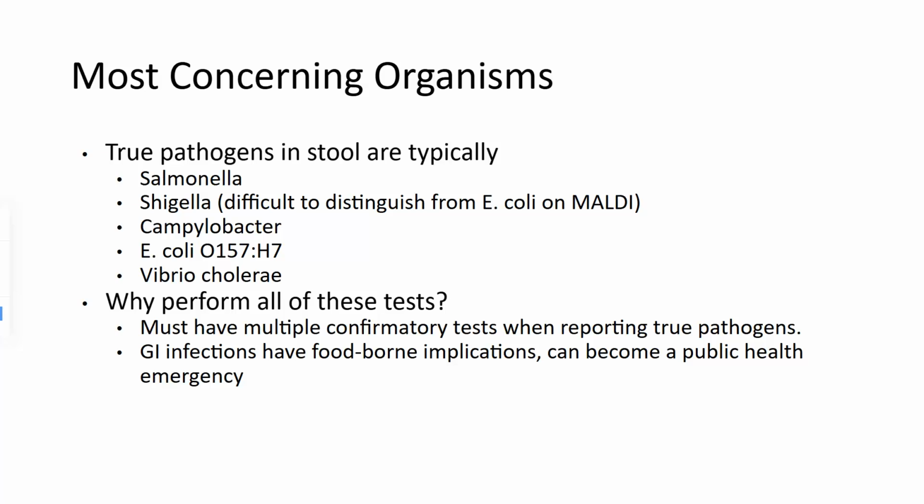and why perform all these tests? We must have multiple confirmatory tests when reporting true pathogens. GI infections have foodborne implications and become a public health emergency. So we really need to ensure that it is what we think it is.